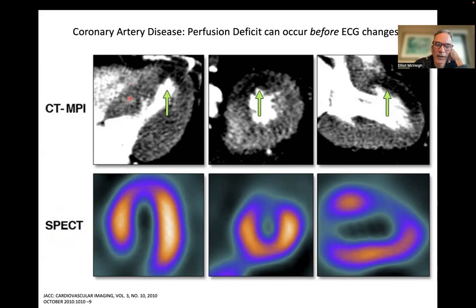And here's a comparison of a CT image in which a contrast agent, a fairly high dose of a contrast agent, which causes the blood to go really bright on the CT image. And this image was made shortly after that injection. So as soon as they see the contrast amplify its concentration in the ventricle, then there's a fixed delay before you make an image.